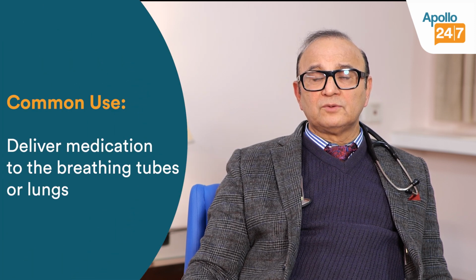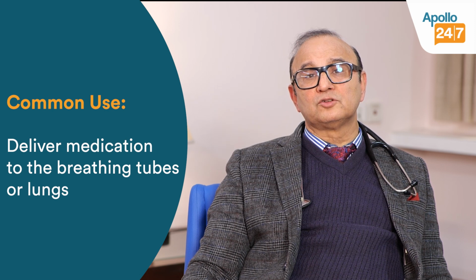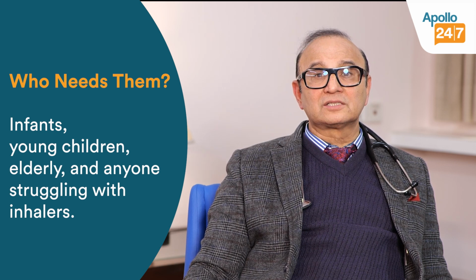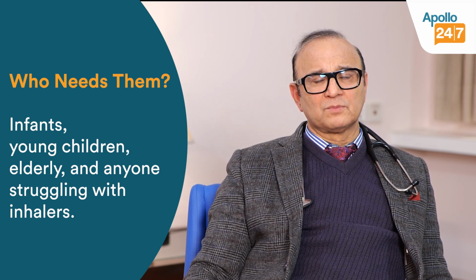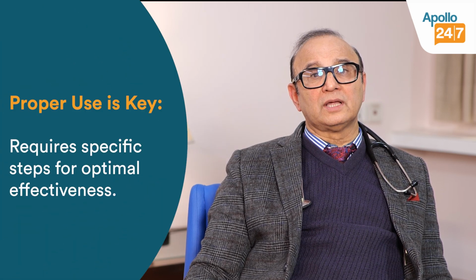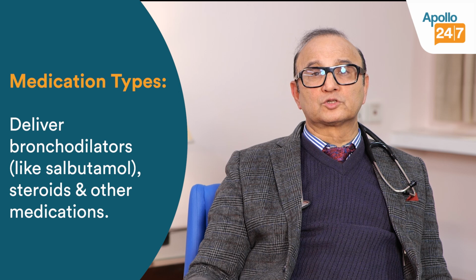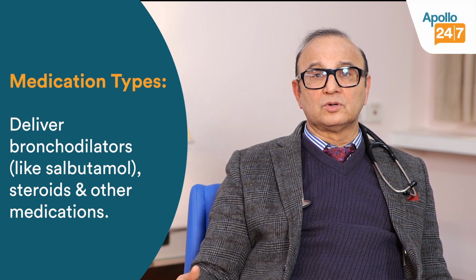Nowadays, nebulizers are very commonly used to deliver the drugs to the breathing tubes and the lowest part of the lungs. They are actually very useful for infants, the young children and the older people, but they can be used for anybody. It is very important when you use a nebulizer to give a drug, which could be a bronchodilator like a salbutamol, or it could be a steroid, budesonide, or it could be a beclomethasone, which can be used. But it is important that you make it properly in a hygienic manner.